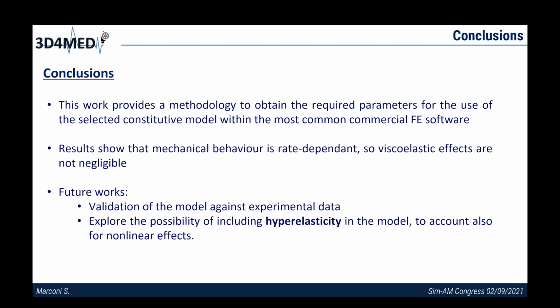Another characterization is the resistance to stitch traction. So we perform one stitch with suture filament over the biological tissue, again porcine aorta, and on a sample material. And then we measure the maximum force load that the material or the porcine aorta can withstand. This is another important parameter because when they are training over the vessel, they need to perform the suture as in real life. Otherwise, they will learn a different gesture. So these can seem to be minor elements, but they are exactly the reason why today we still need to perform the training for surgeons over in vivo or ex vivo or animal models. Otherwise, you will not learn the correct gesture.